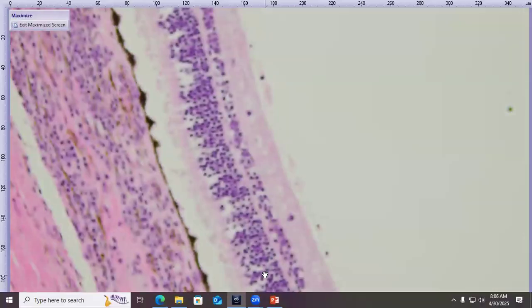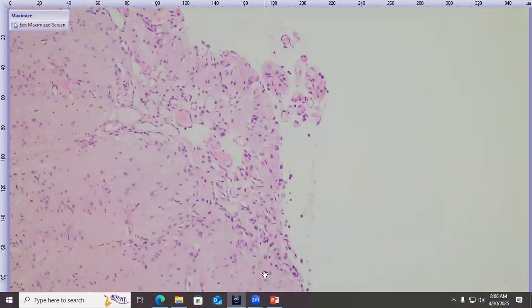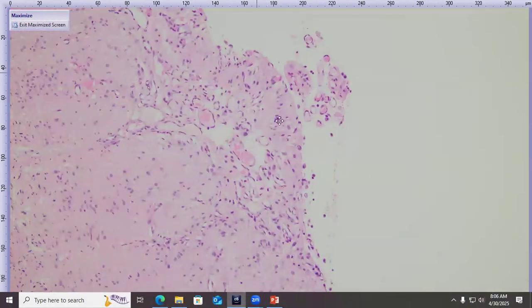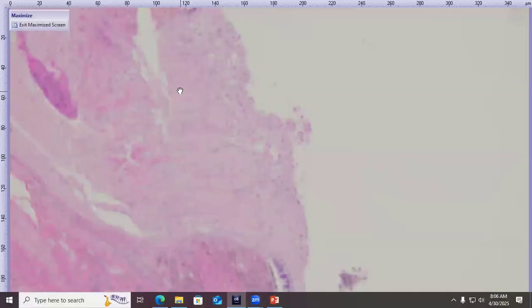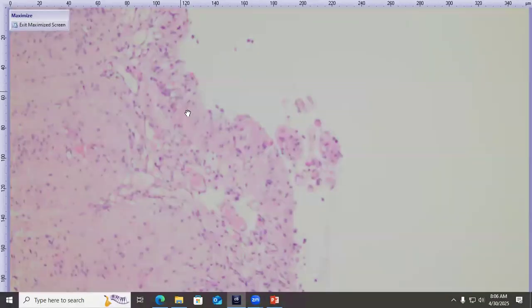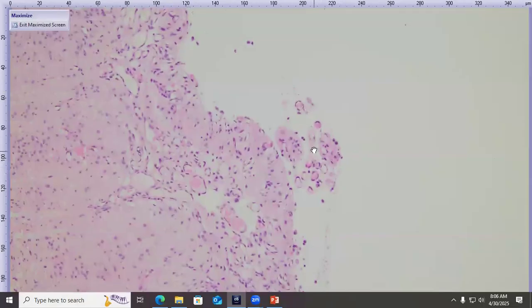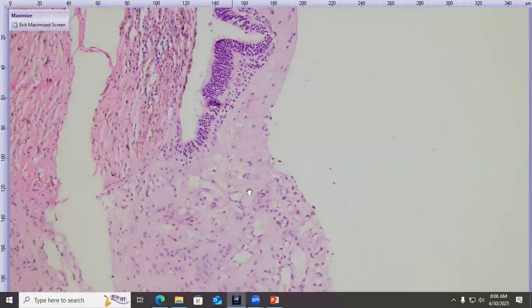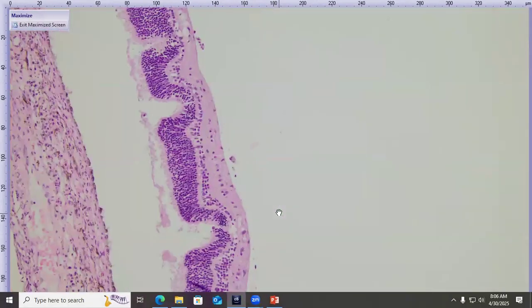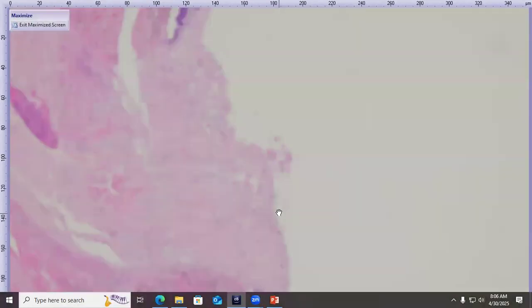And then while I'm here, we can also point out a normal structure of the marsupial. So here, let me back out one more to show where we are. So we're at the optic nerve head right here. We can see the retina on either side, and kind of emanating from the optic nerve head, there's this tuft of vessels. They're kind of going a short distance into the vitreous here, and then they're also extending a very short distance through the nerve fiber layer. Then the rest of the retina is relatively avascular. So normal finding in a marsupial, but kind of just a fun feature.